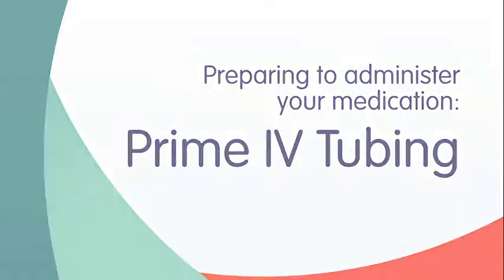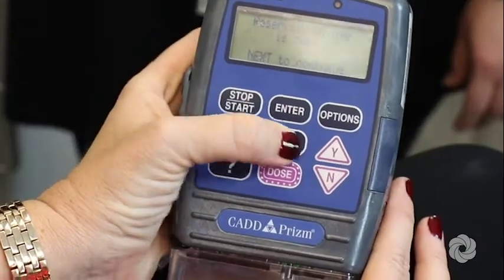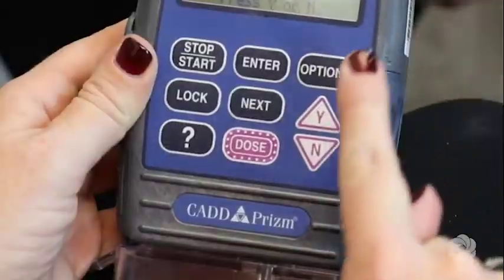You are now ready to prime your IV tubing. When priming the tubing, make sure the tubing is not connected to the patient. Press the Next key. When the screen reads 'Reset Reservoir Volume,' press the Y key.